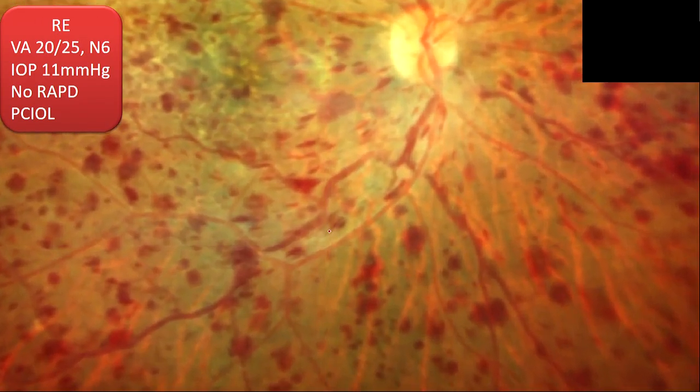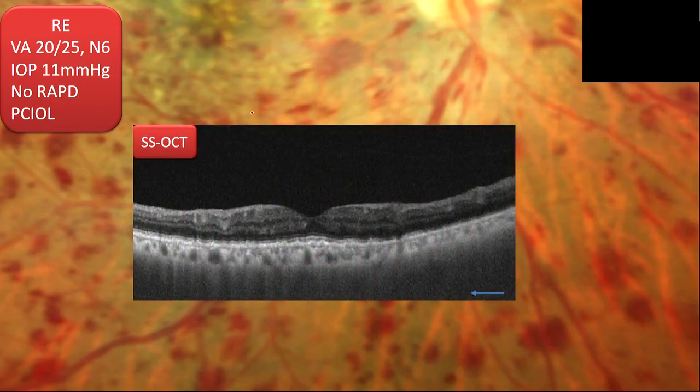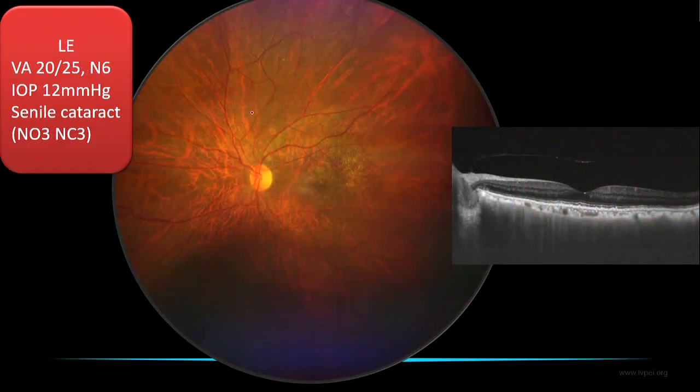When we see closely at the posterior pole, there is presence of multiple superficial hemorrhages also. However, the OCT showed no macular edema, so at this visit the patient was advised to observe. The left eye also had presence of dry age-related macular degeneration changes. The left eye remained normal throughout the course of visits, so I'll be discussing the right eye in the subsequent slides.